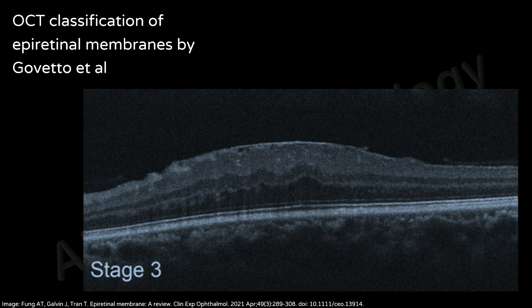Stage three is defined as the presence of an ERM with continuous ectopic inner foveal layers anomalously crossing the central foveal area. The foveal depression is absent and widening of the outer nuclear layer is often less pronounced when compared with stage two ERMs. In stage three ERMs, all retinal layers are clearly identified on OCT.